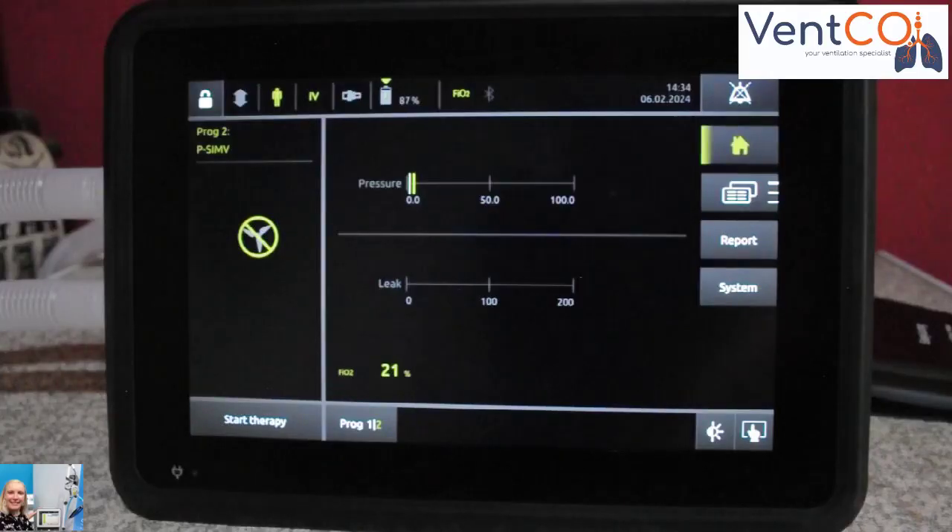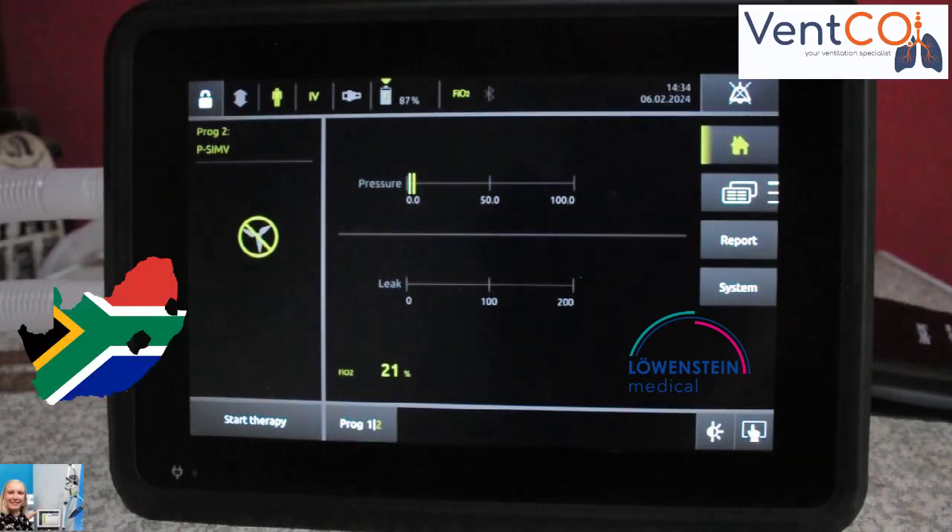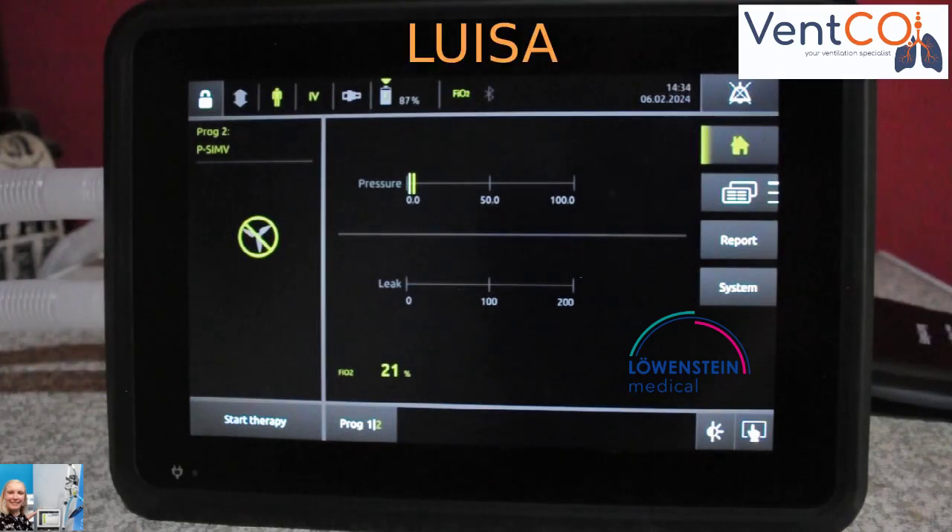Hi guys, Yolanda here from Vent Company, your Ventilation Specialist. We are the proud distributors for the Löwenstein XU and Home Care Ventilators in South Africa. And today I'm going to tell you a little bit more about the Luisa Subacute and Home Ventilator.